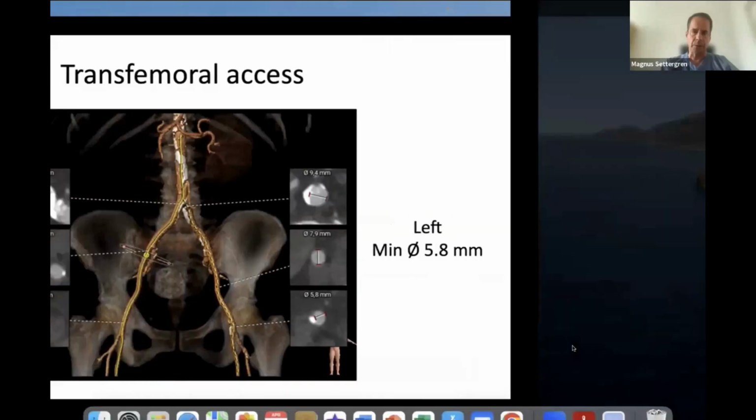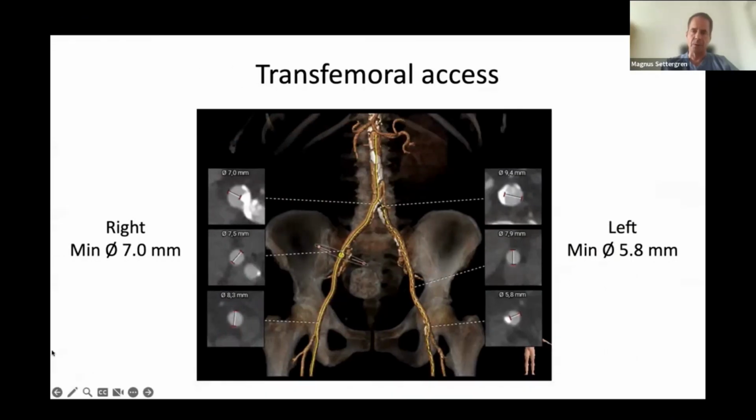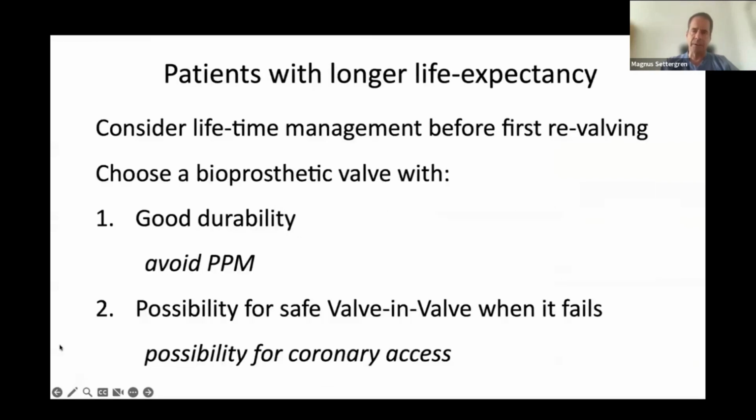But if we start with the first issue here about her body size, BSA of 2.0 square meter and her relatively small aortic annuli, I would say she's probably a patient who could be at risk for patient-prosthesis mismatch. So I completely agree on that. And this is also something that we always take into account nowadays when discussing these patients. So even if she is 67 and has some comorbidities, I think the size of the annulus should always be in the discussion when we discuss these patients.